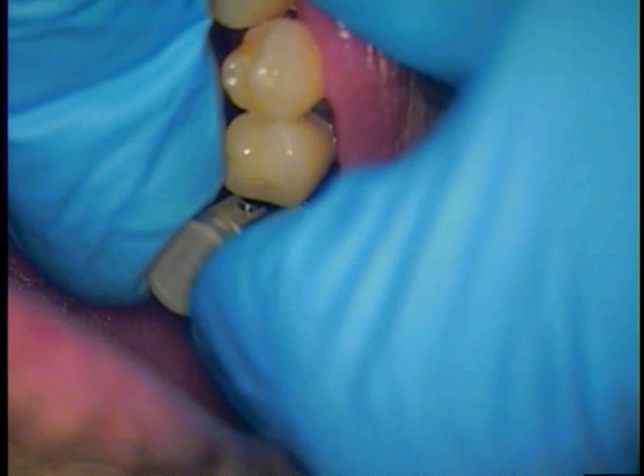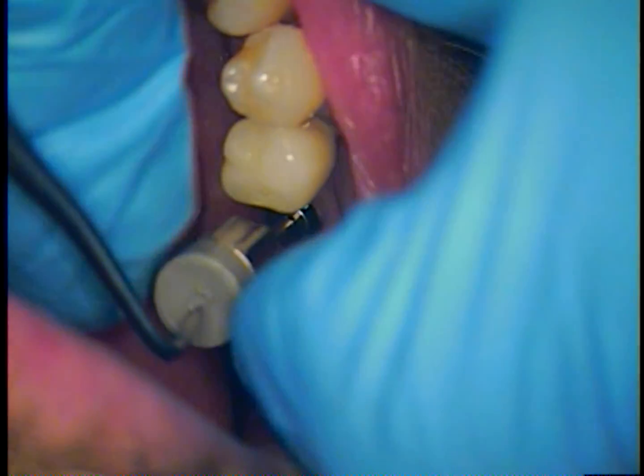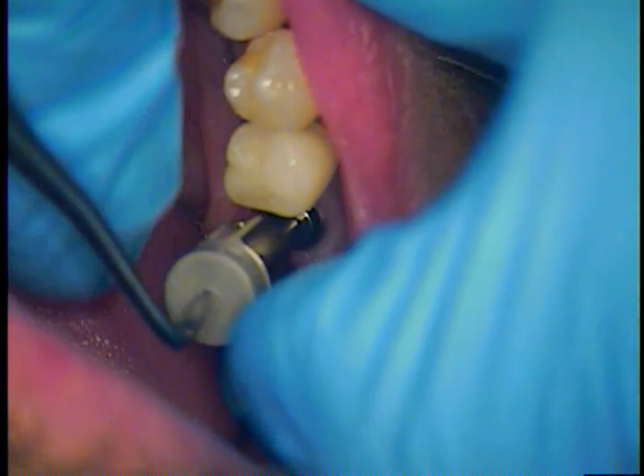And now we're going to go in. I'm going to use a reverse mode here. We'll hold it in place and then just tighten it. And there it goes.